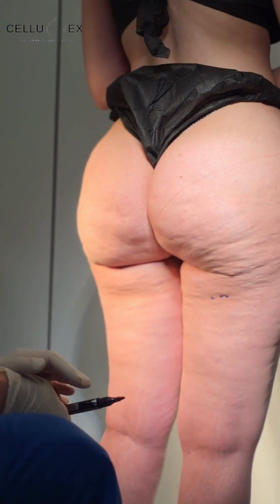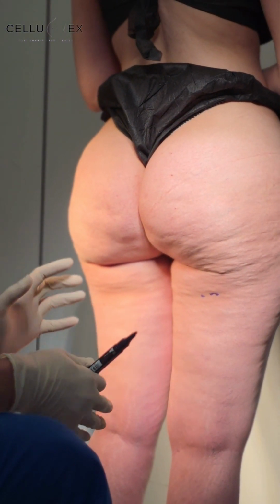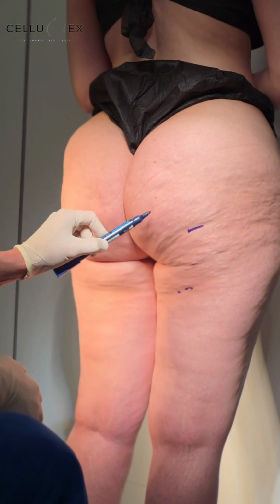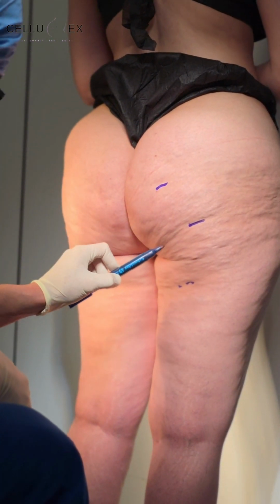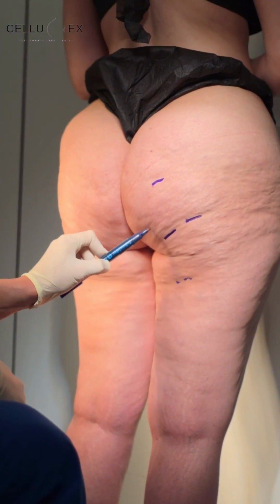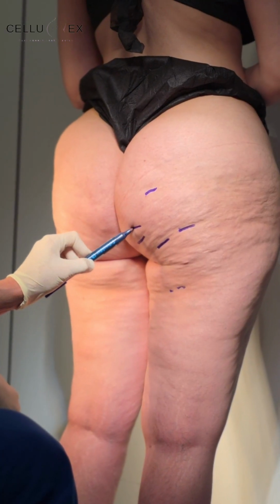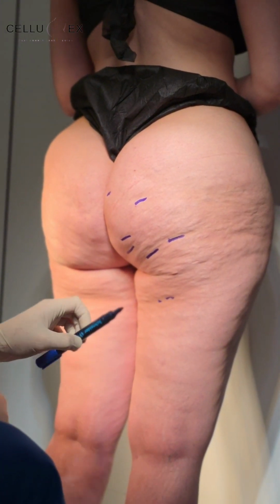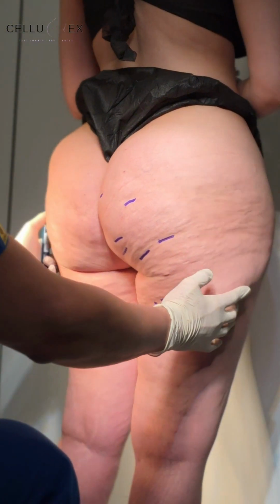this area. What you ask the patient is to tighten their buttocks. Please tighten your buttock. You see these areas. These are cellulite areas. So you mark them each, and then you turn the patient to the side.